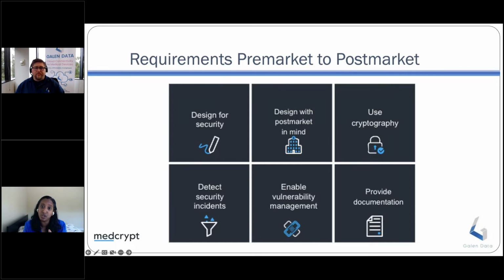You need to have a more constructive effort from the device maker to maintain the security posture over the lifetime of the device. And that's exactly what this slide is outlining here. The FDA, as the US regulator, has made their position very clear in terms of their expectations. If we look at the history, in 2016, they issued their first version, it was like 8 pages. 2018 had an update that was like 20 pages. And just in April of this year, their update was like 50 pages long. So it's clear that they too are maturing their perspective on what the expectations are.